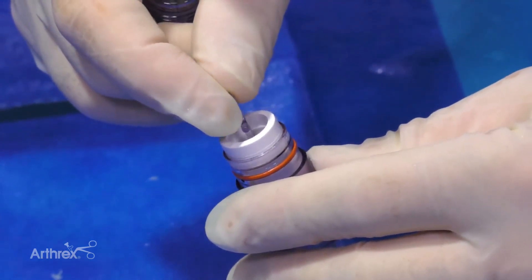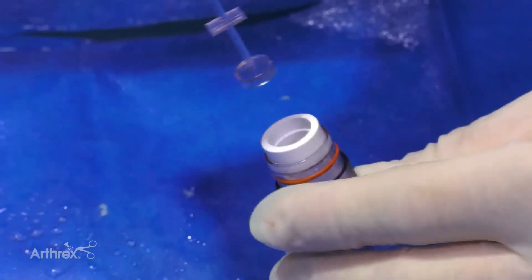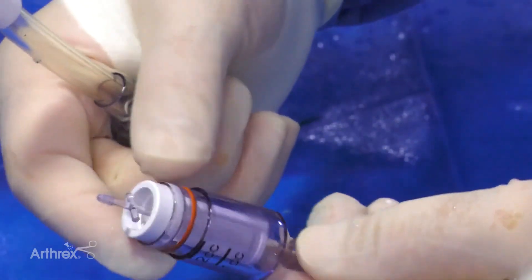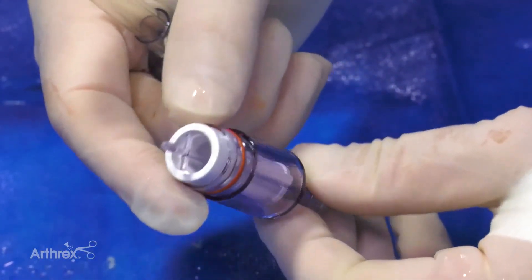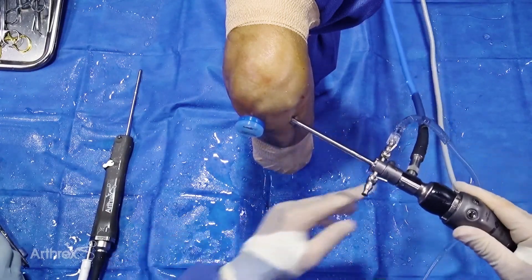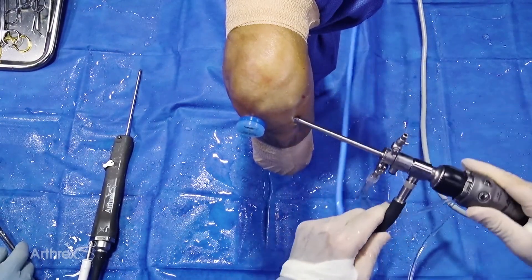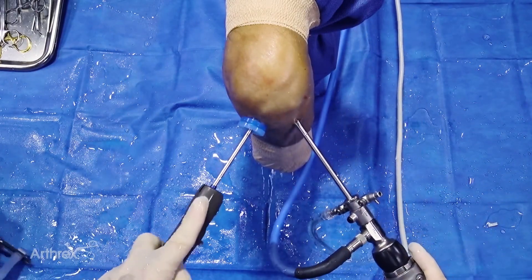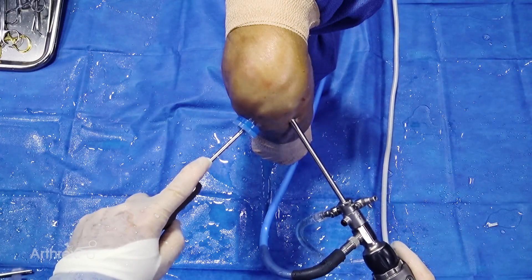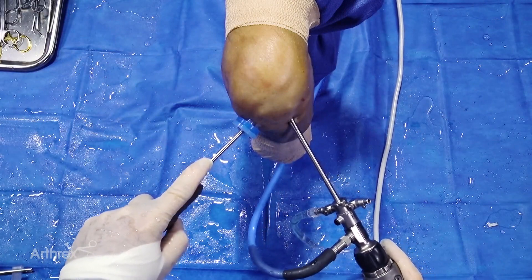There's an inner receptacle that will serve as a filter and capture whatever material you're harvesting — it could be cartilage or bone for various applications. The T-handled tissue plunger will capture material on its surface, with fluid passing through the mesh to isolate the tissue. We have a passport cannula to control fluid egress and allow instrumentation. This is a 1 centimeter diameter by 2 centimeter length. We're using a 5-0 bone cutter on oscillate to get the proper particulate size.